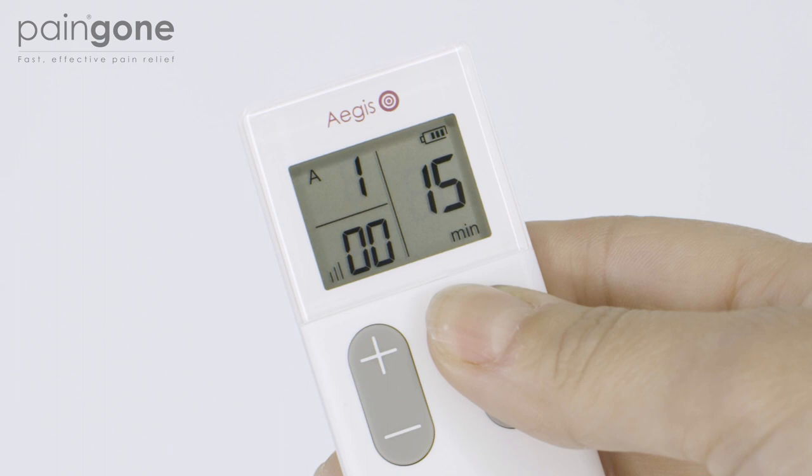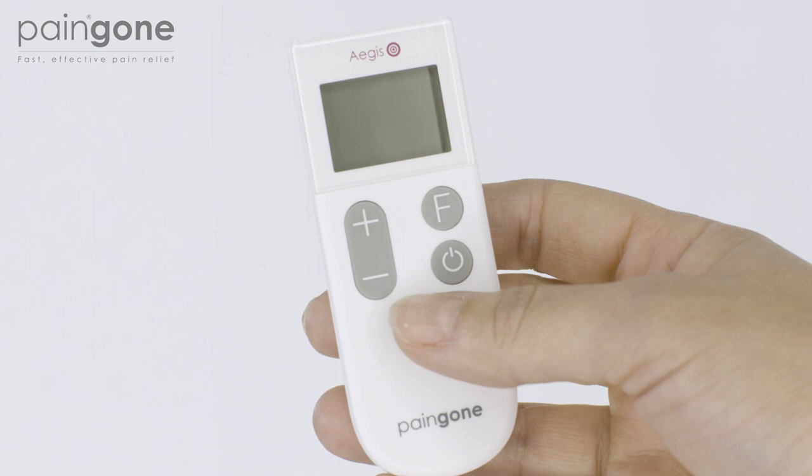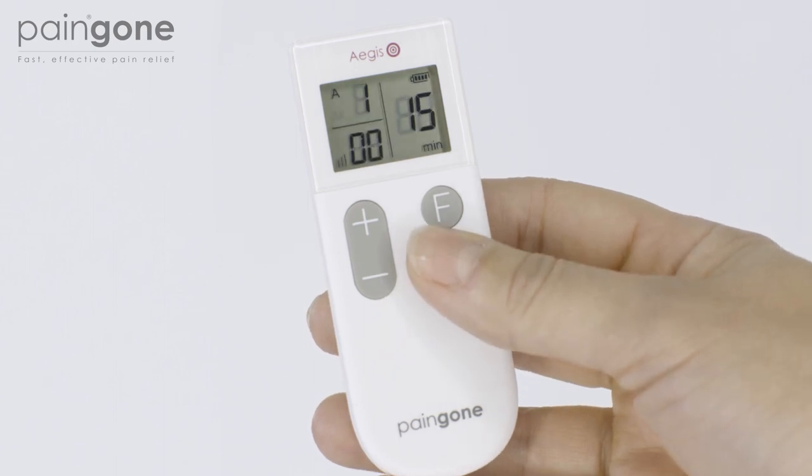Each session lasts for 15 minutes. The remaining minutes of the session are displayed on the right hand side of the screen. The device will automatically turn off after 15 minutes. Re-activate the power unit and then the remote if you wish to begin another session.